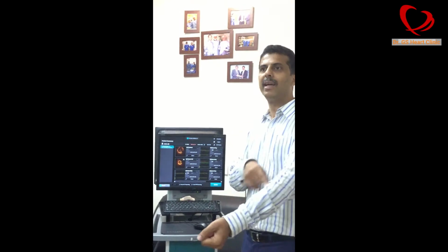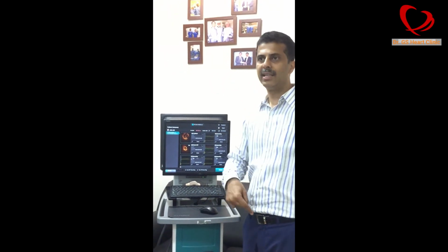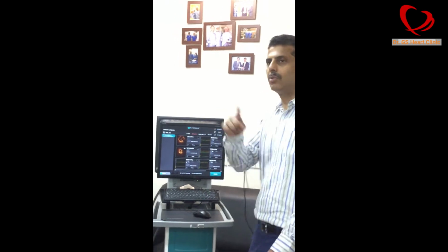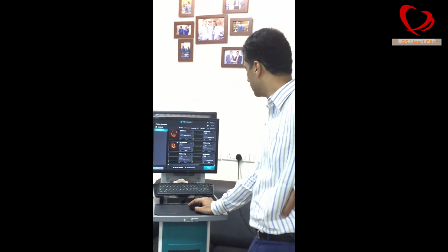Using angiographic guidance. Again, I told you we had some difficulty in his hand, but we went through a 5 French guiding catheter with the backup of another guiding catheter in case of an issue. We did a left main stent. We put one stent from left main to LAD. And then we repeated another OCT.